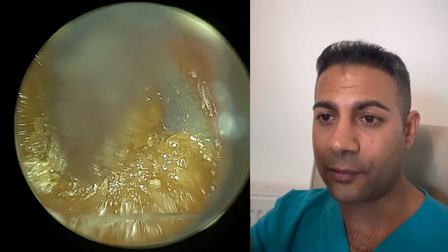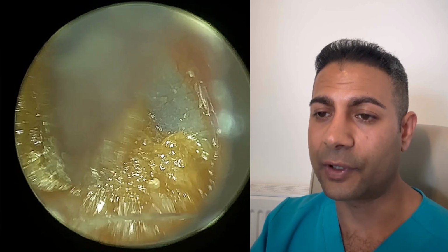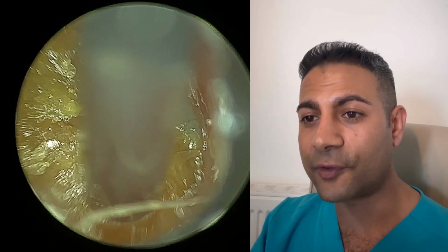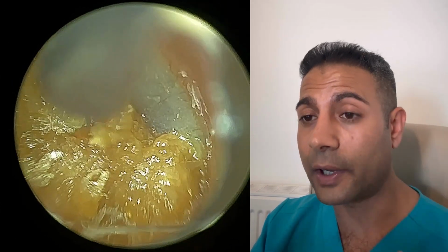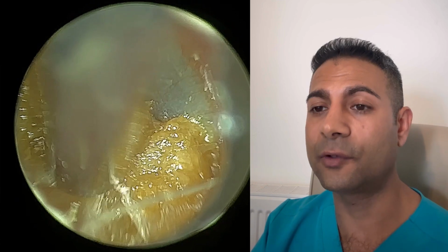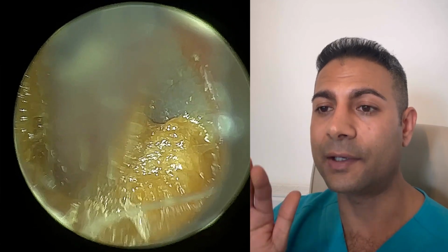So we've already revealed the eardrum at 3 o'clock, so that's the posterior part. And it would have been far easier if this patient's wax was really dry and firm, because as soon as you make contact with it, it will peel away. But because of its soft nature, it is embedded.